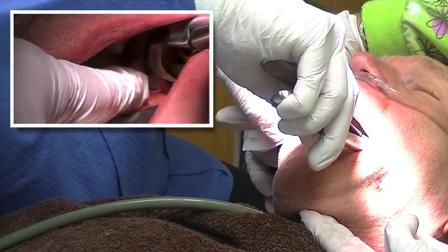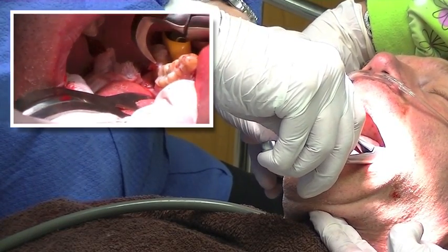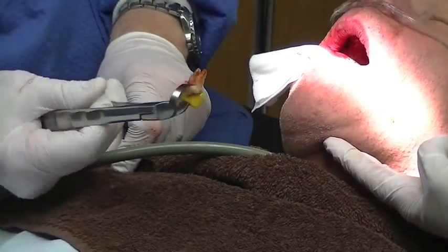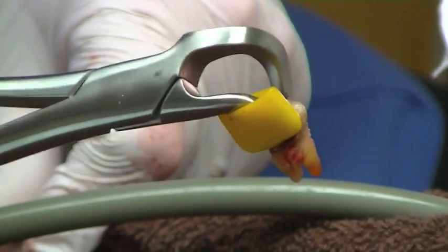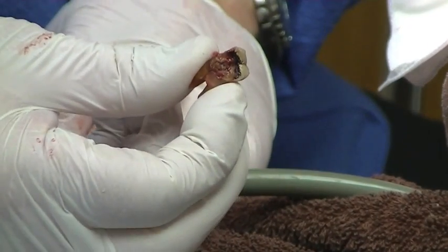Did you see that? That tooth just popped right out. Now if that's not magic, nothing is. That's a wisdom tooth, way back there, shallow vestibule — this is the instrument to use, the 400 series. You can see how decayed that buccal surface was. Magic.